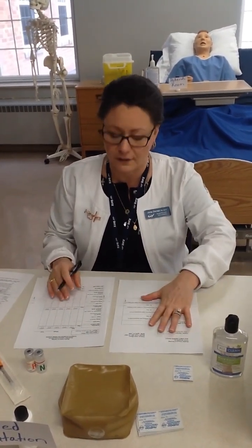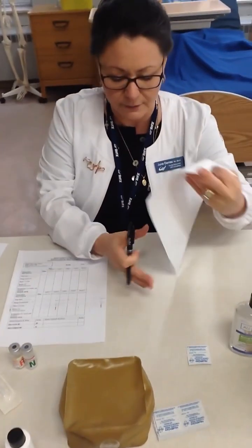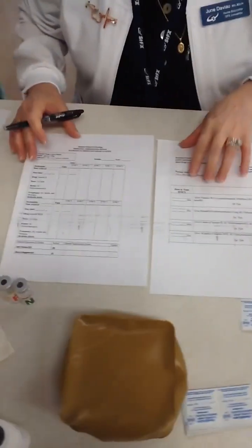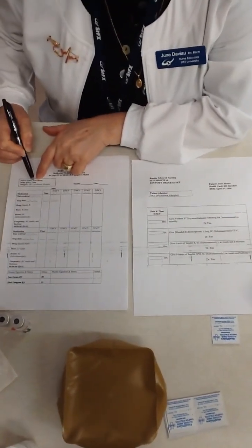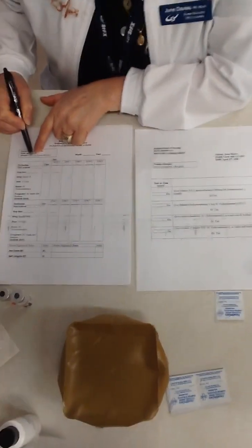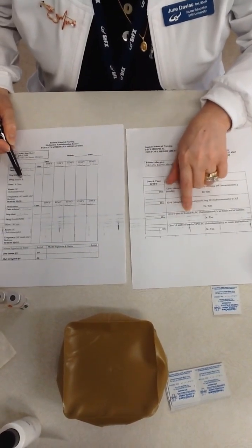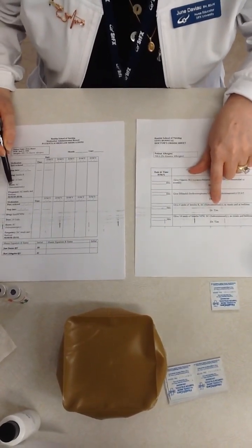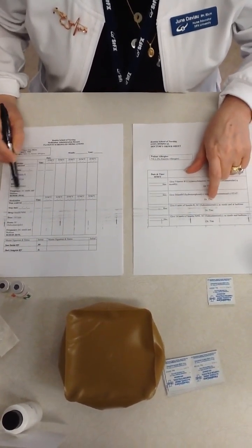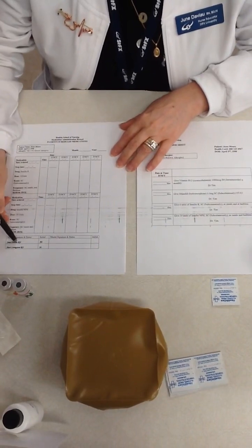So my next step, and this always follows through: check your doctor's order, then compare it to your MAR, your medication administration record. If we compare those things, starting at the first drug, it says give 6 units of insulin R. Of course, I'm going to check first to make sure I have Jessie Moore, a date of birth, and no known allergies. Then I'm going to move down and see that my first drug is insulin R, 6 units, 6 units. The route is sub-Q, subcutaneously. The frequency is before meals and bedtime, before meals and bedtime. It's been checked by 2 nurses and their master signature is signed.